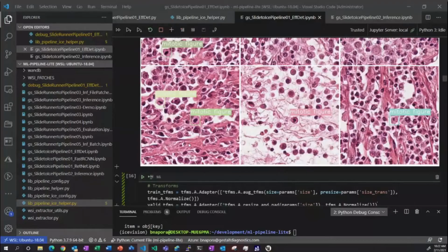And so images coming from different devices should have the same color? Well, they will not. There'll be variation in that. And in fact, I should bring up, if I can, I can't find the paper.